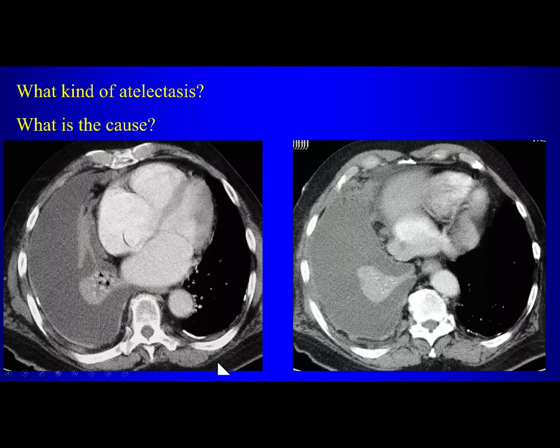Yes. Can you have a benign pleural effusion from asbestos exposure? Yes or no? Yes, absolutely. Are you concerned this is malignant? You mentioned what tumor? Mesothelioma. So do you think this is mesothelioma?